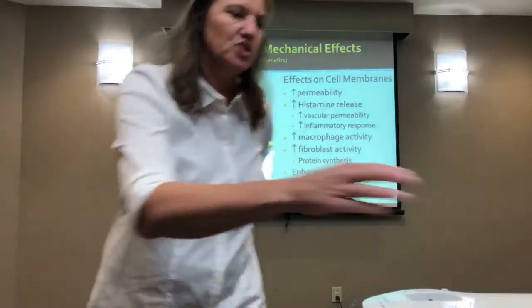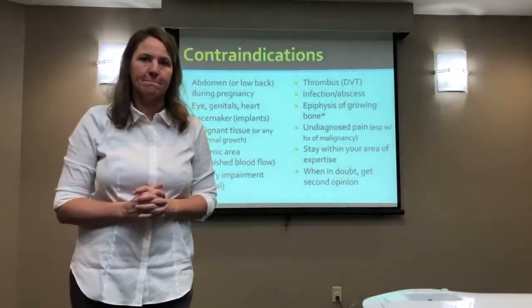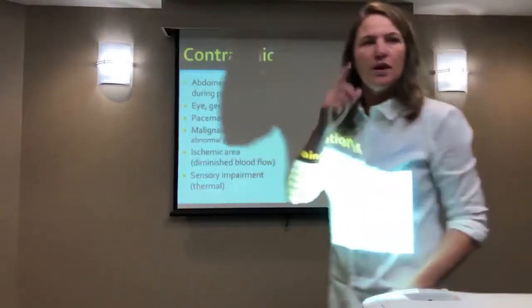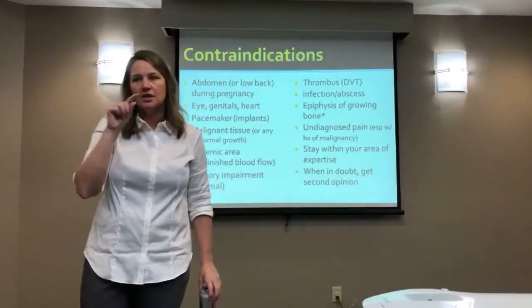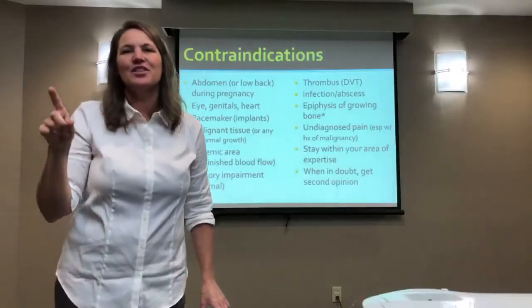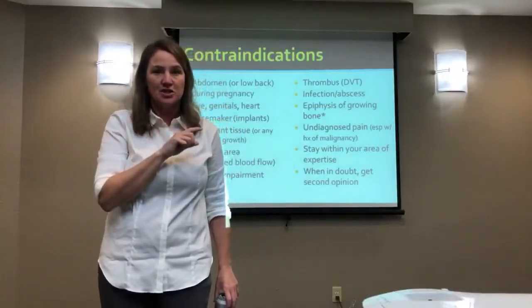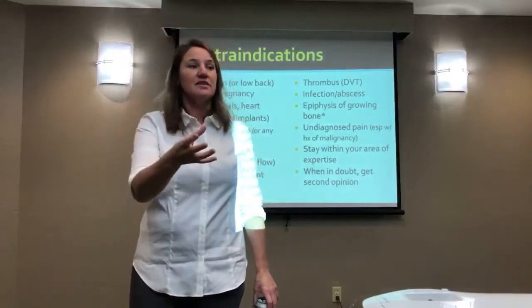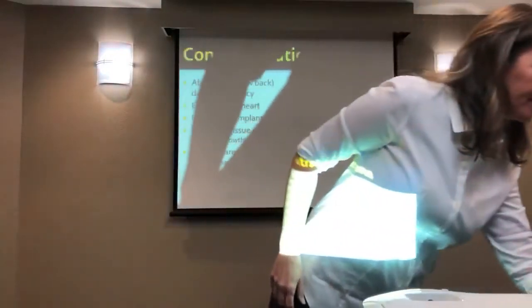Okay, questions? So if you're using thermal effects at thermal level, you're still going to have all these. Yes, right? Very good point, is even with thermal, you get non-thermal. I shouldn't say nominal. See, that was a really wrong statement. Even with thermal, you get the mechanical effects. So you're getting the physical vibrations. It's whether you're getting them rapidly enough and aggressively enough to build up heat in the tissue at any given time.